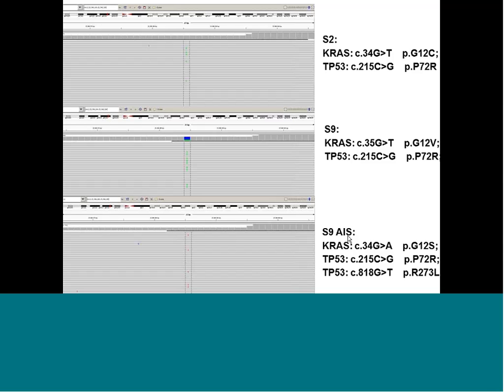So this really influences the standard diagnostics and the clinical decisions of what patient to surgically resect and what patient to render to chemotherapy.